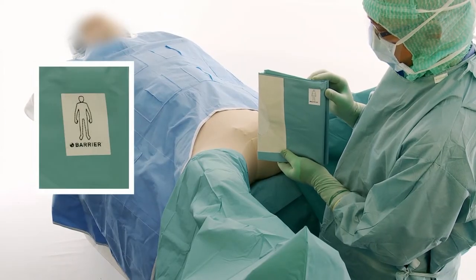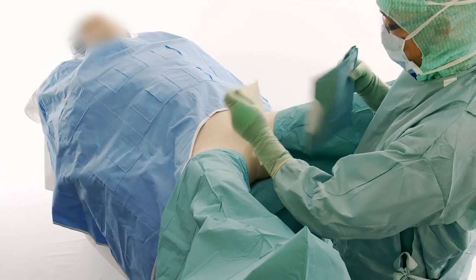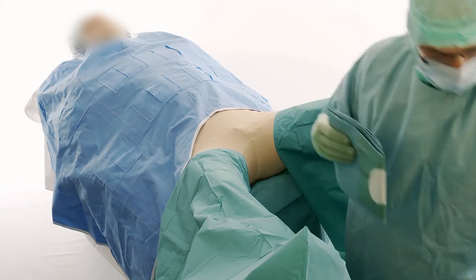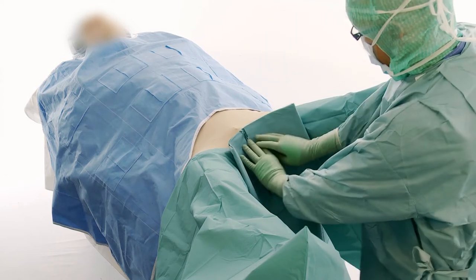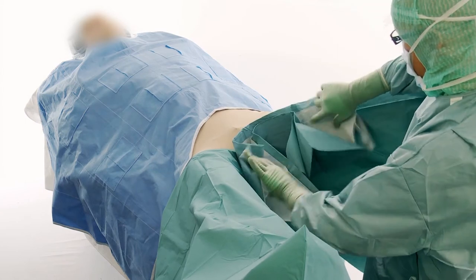Note the direction of the pictogram on the Lithotomy drape. Remove the release paper. Place the Lithotomy drape in the centre of the genital area. Unfold towards the head and towards yourself.